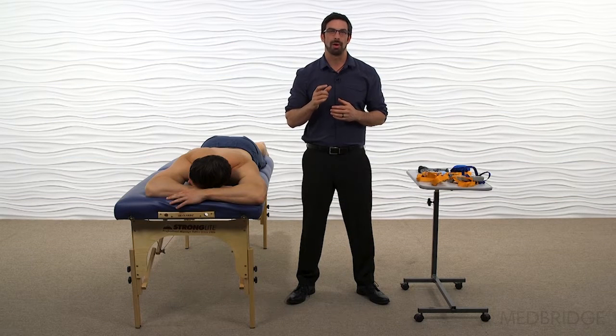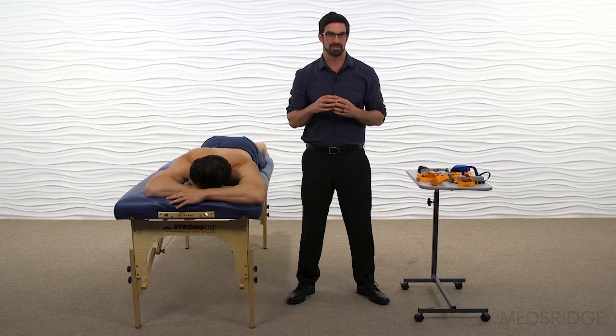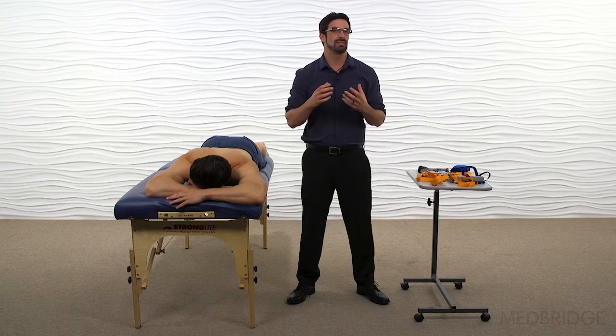We're going to perform a dynamometer assessment of muscle strength. Classic manual muscle tests only test the weakness of the muscle and the timing of motor contraction, and potentially any compensations. But to truly test strength, we need to test the MVIC of the muscle.